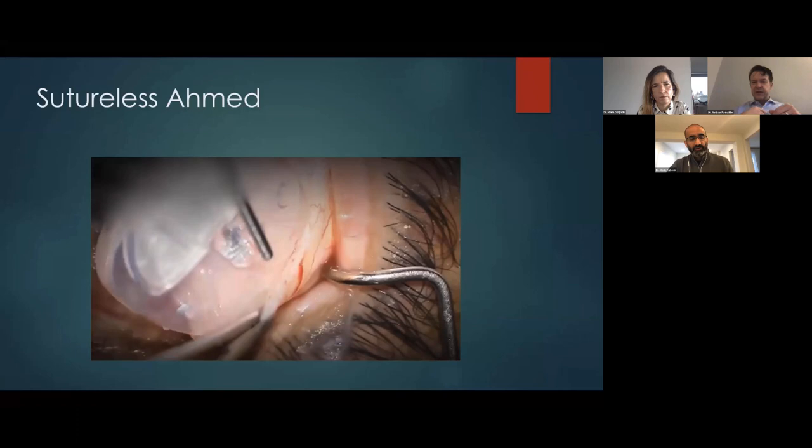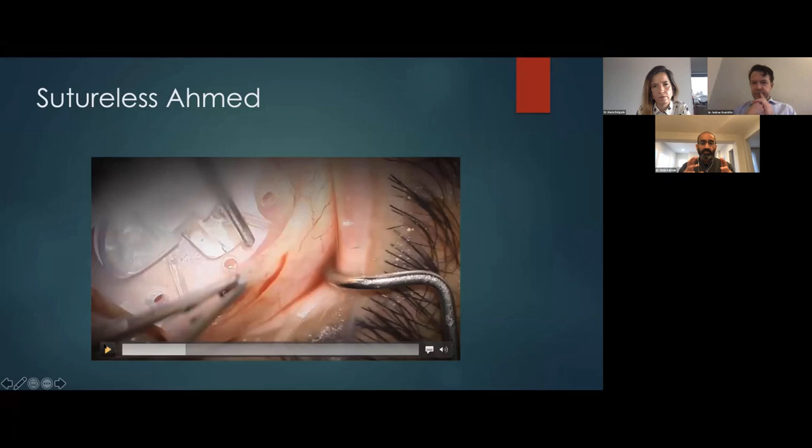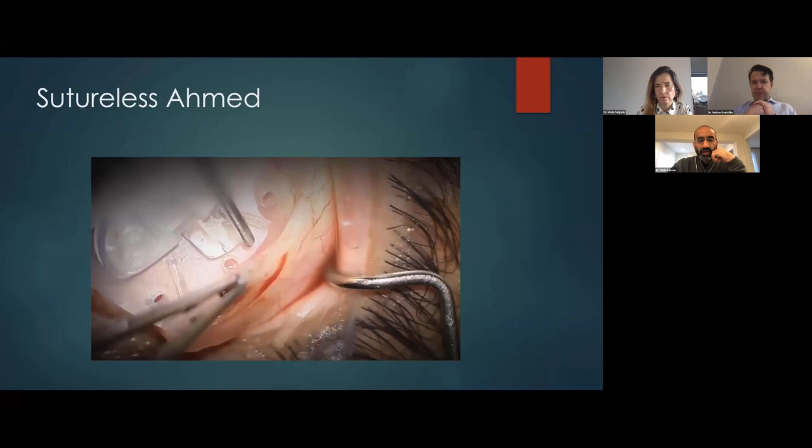Nate, I have a question for you. So you said you want to have the pocket hold the Ahmed plate. Are you controlling that by how far you're separating the scissors? Yep, okay. And you'll notice it's a tight squeeze even with me getting this tube in through my conjunctival dissection. So I don't want this concept of over dissection, which was never a concept when you're sewing. You want over dissection if you're sewing. Right. But the concept of this surgery is we're using the tissue to maintain some stability and some structure, and making smaller pockets that almost squeeze your implant are going to help you here. And ideally there's a bottleneck right after this goes in that won't let the tube slip forward, because I haven't dissected enough conjunctiva to allow that to happen.